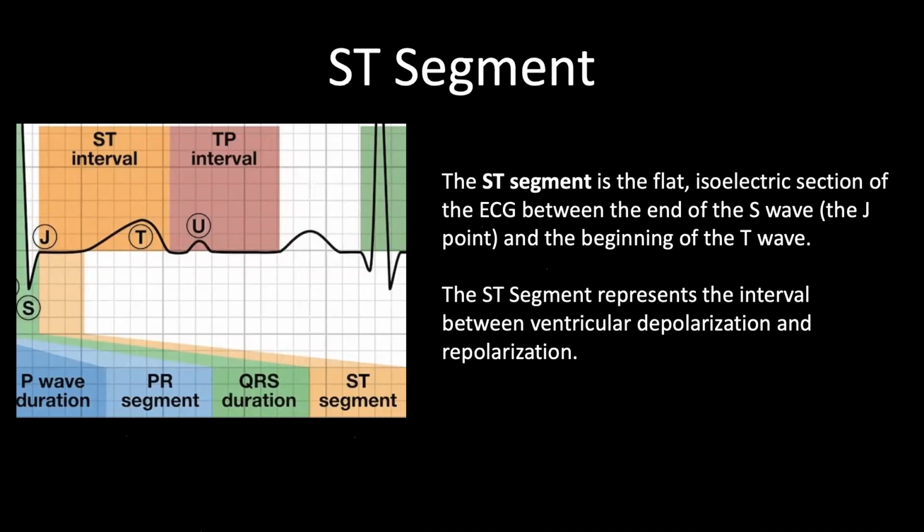And there's something called the J point. Now, the J point, or the junction, is basically just that recognition of that termination between the QRS complex and the beginning of the ST segment. And it's quite a good demarcation between that, and depending where that J point is, because it can go up, of course, in ST elevation, for example, or it can go down as well in inferior MIs, and that can move around. But it's just a point at where that transition is.